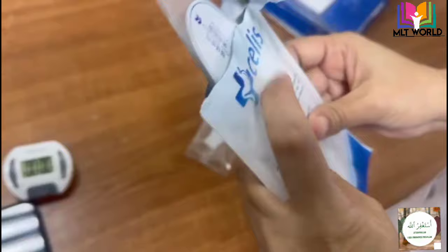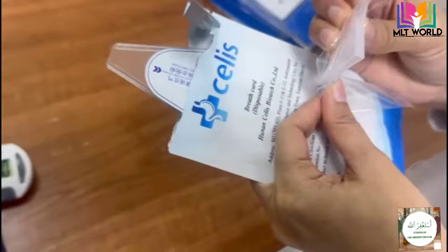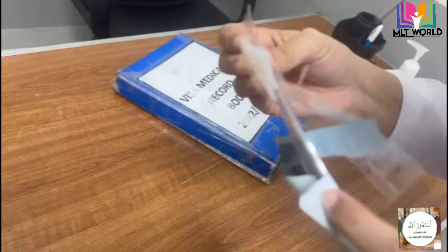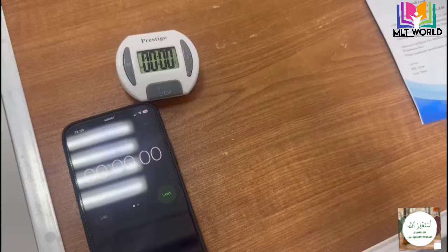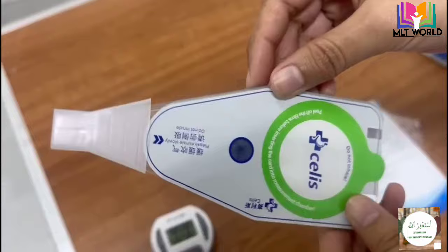The most important precaution: tell the patient to inhale through the nose, not the mouth, and then blow air out through the mouth. Also, do not inhale back the exhaled air. First put the breath into the card, then remove the card from the mouth, take a few seconds rest, and then breathe again.